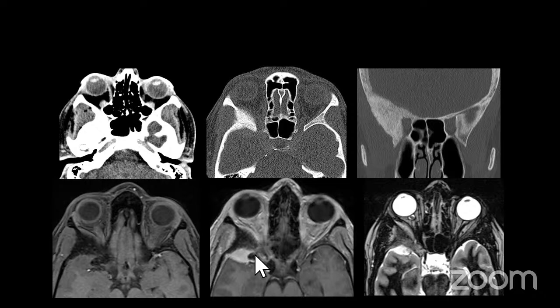The next thing is that when you do your MR studies, just make sure you do really thin section imaging. One of the biggest pitfalls I see is that people are working on patients with cranial nerve palsies and they're just doing standard imaging. You really do need to do dedicated imaging in order to see some of the anatomy that we talked about before.